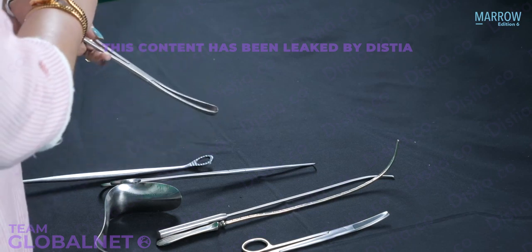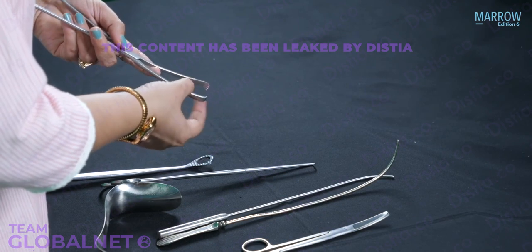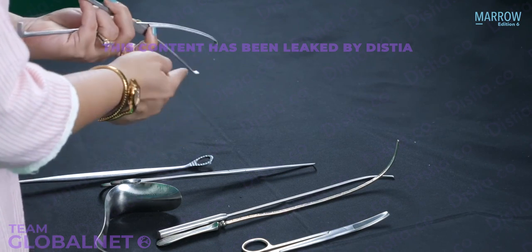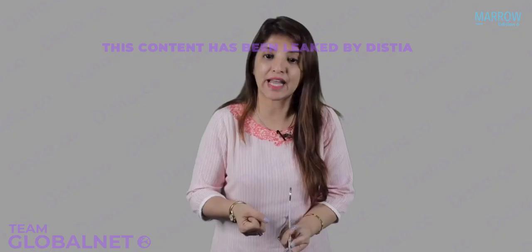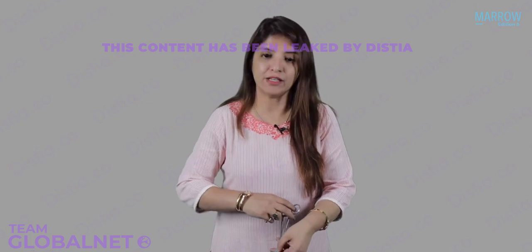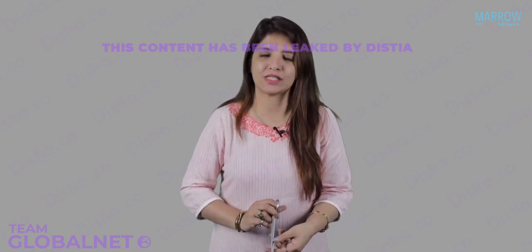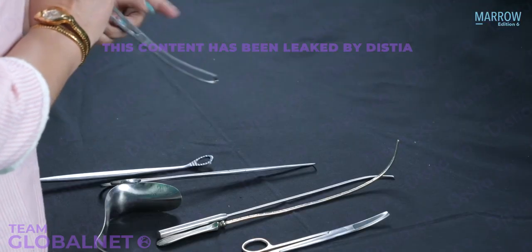Now, when I'm going to open the blade, you are going to see that it has got rat-like teeth, multiple rat-like teeth which are present on both the ends. Right, so it helps in grasping the anterior lip of the cervix. Now this over here is a vulsellum, and whenever you have to apply a vulsellum to hold the anterior lip of the cervix, the concavity should be facing upwards.